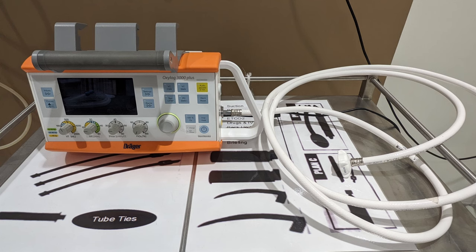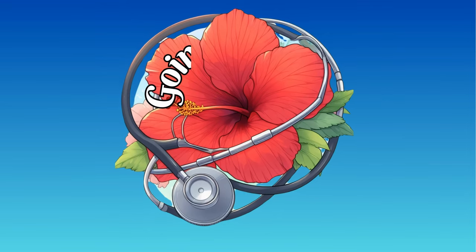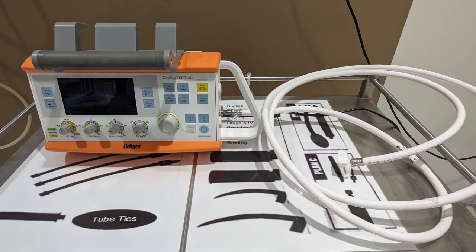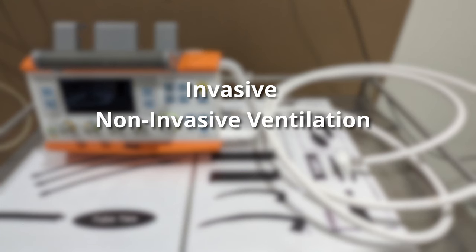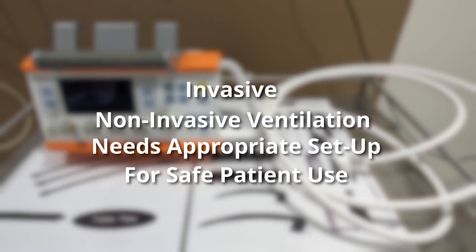Hi team, today we're going to look at how to set up the OxyLog 3000 Plus as a non-invasive ventilator. The OxyLog 3000 Plus is a solid, reliable transport ventilator and can be used for both invasive and non-invasive ventilation. However, you need to set it up appropriately to make sure that it's safe for use with the patient.